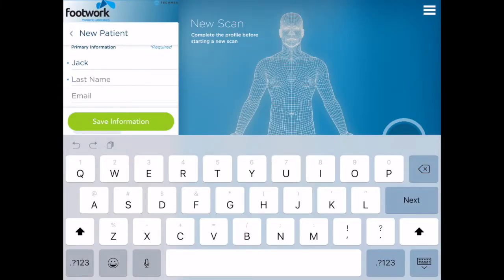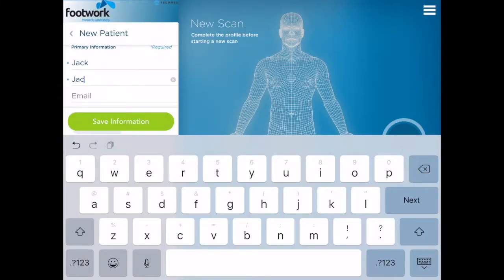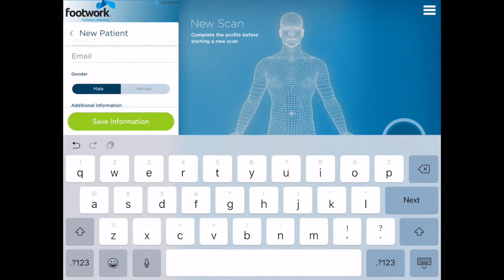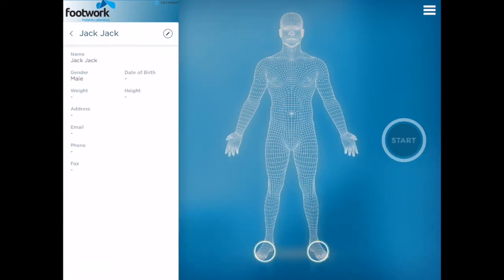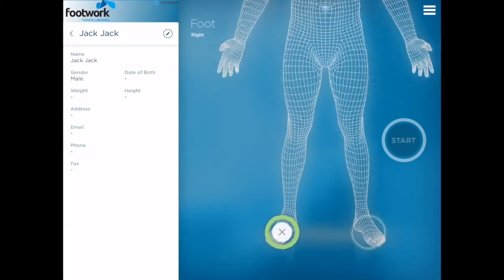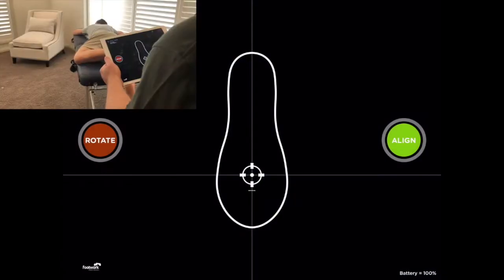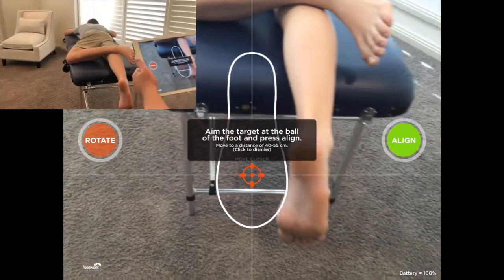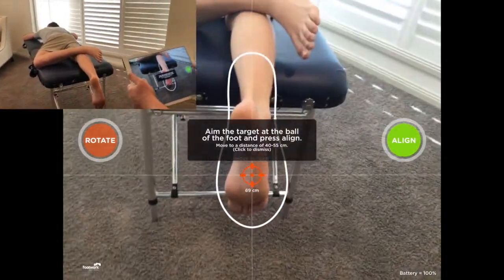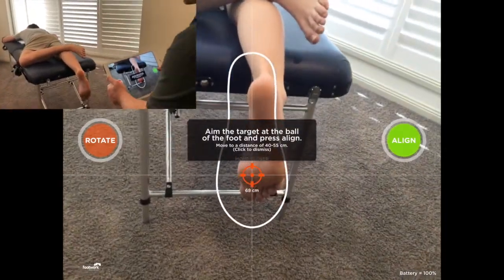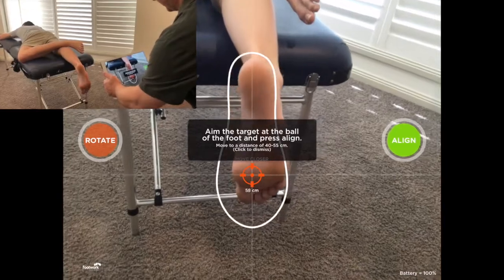So as previously, you enter the patient's name and save it — answer correctly because that information is being transferred eventually onto your orthotics themselves. Select your right foot and now you can see an outline shape of a foot. You place the target area on the foot and move it in closer until it goes green, then press Align and Start Scan.